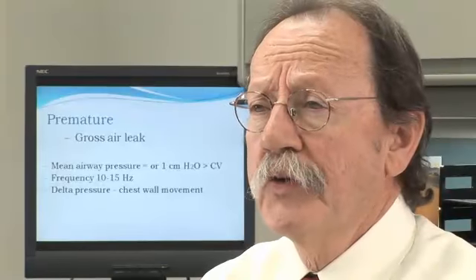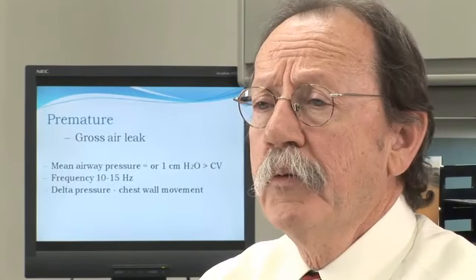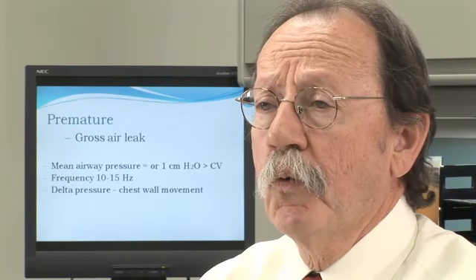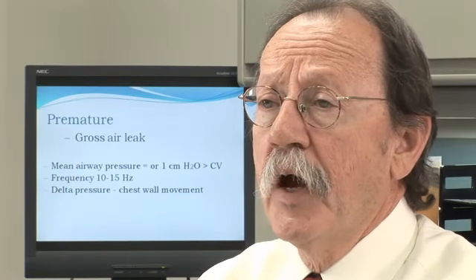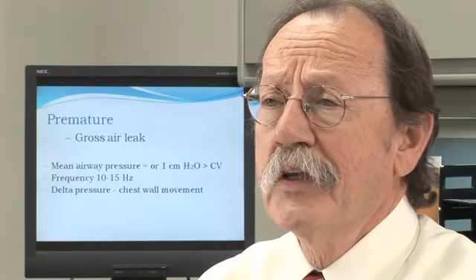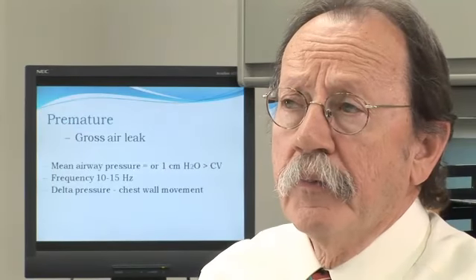If you have gross air leak, typically we would use a mean airway pressure that's equal to or one higher than conventional. Again, rapid frequencies to minimize pressure changes in the lung where the air leak has occurred. And you want minimal chest wall movement for these patients.